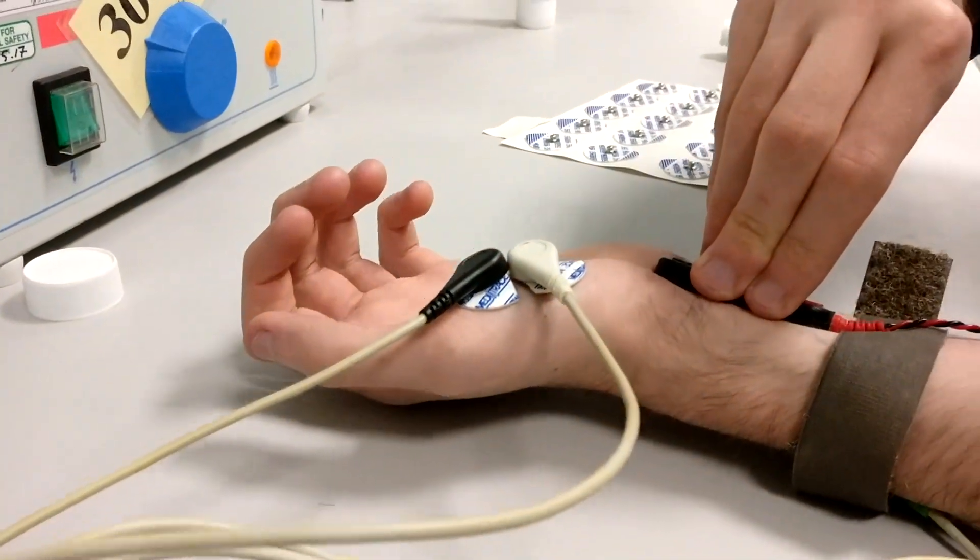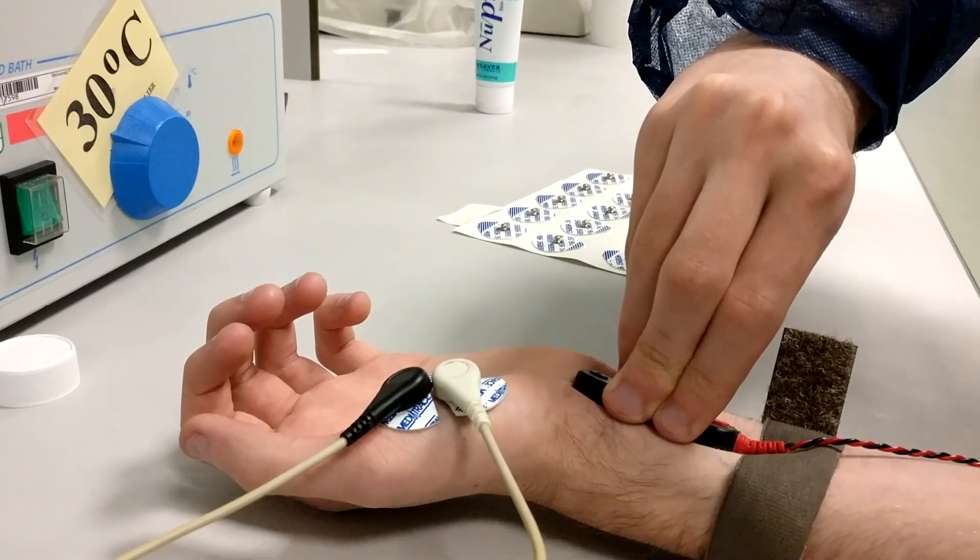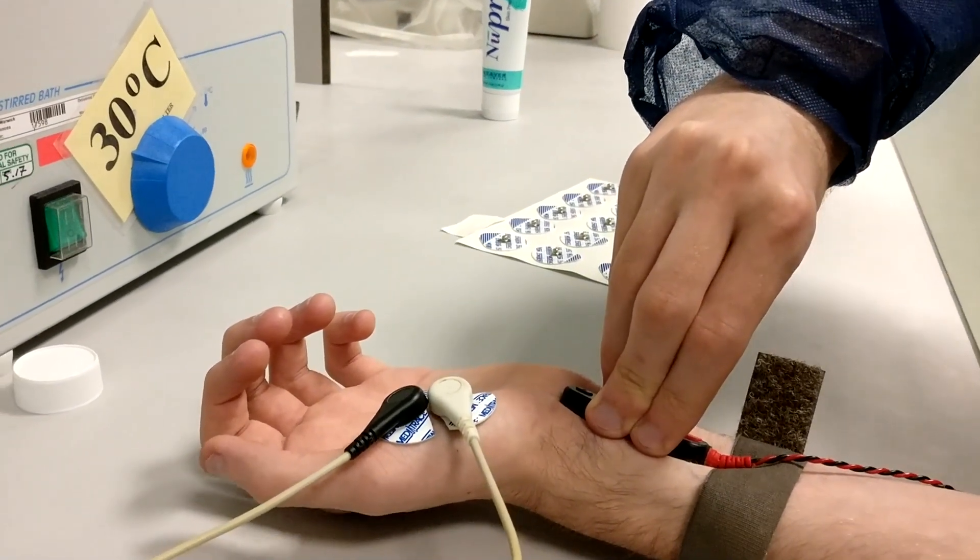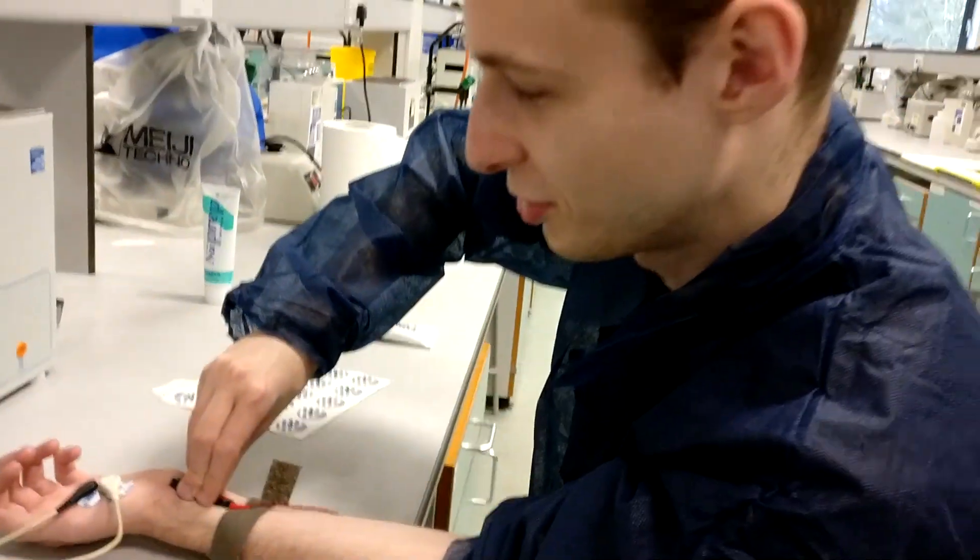This is four hertz. Look at that going. Again, this is four hertz, the same as a benign essential tremor.